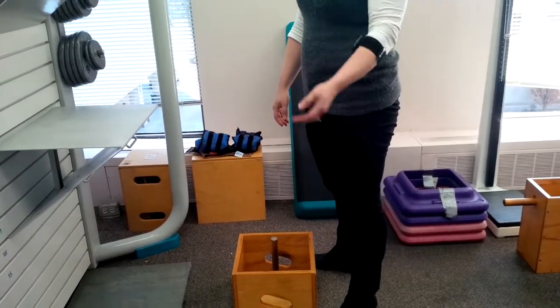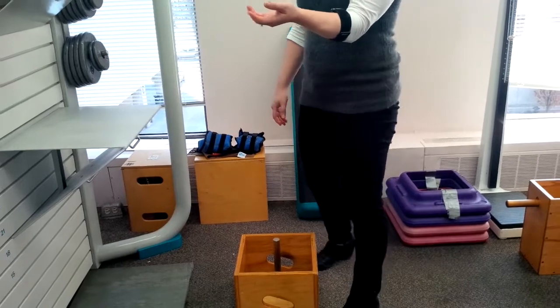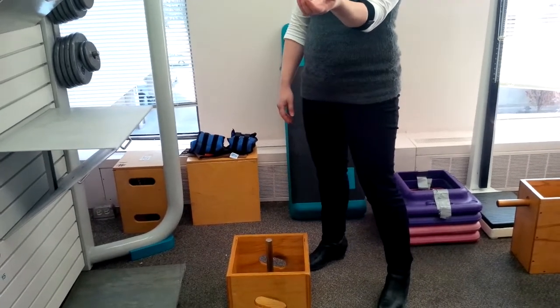So in our rest period, can you just kind of watch the heart rate? What do we got going there? 105. 105, so we watch your heart rate.